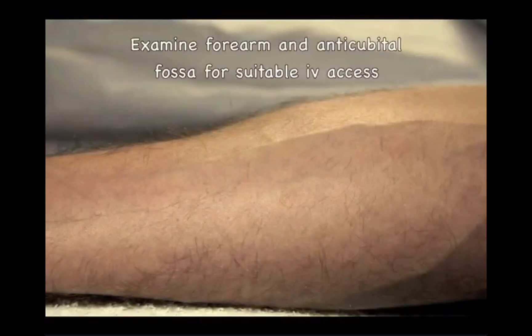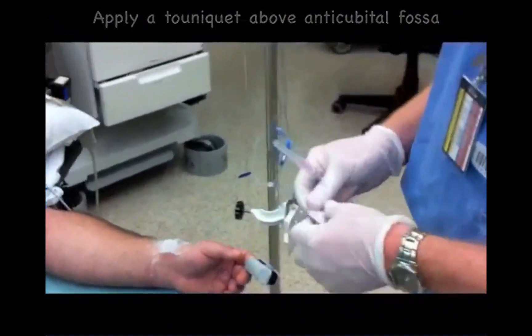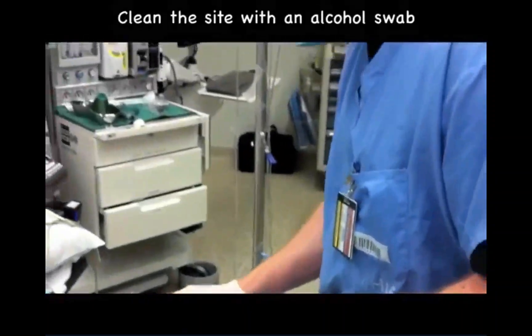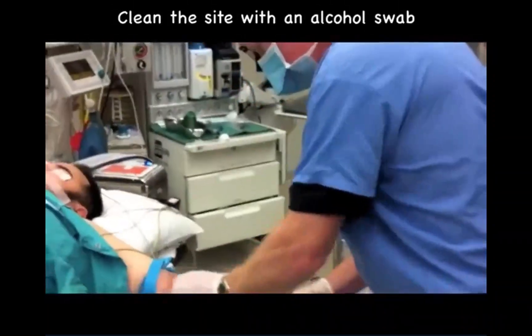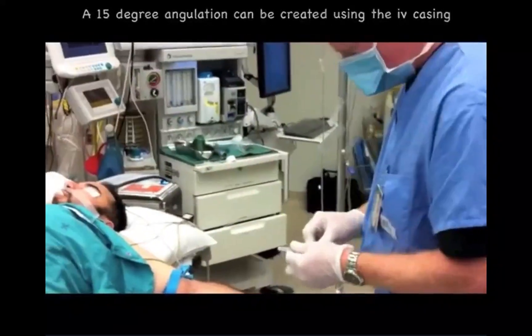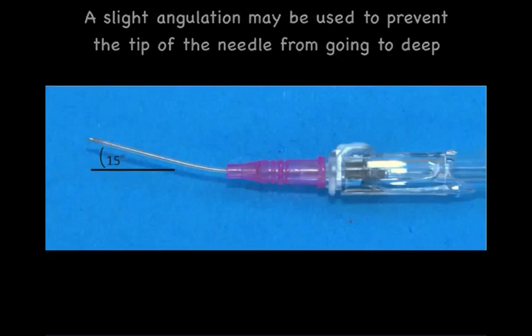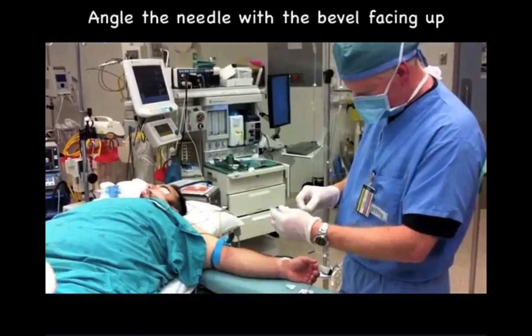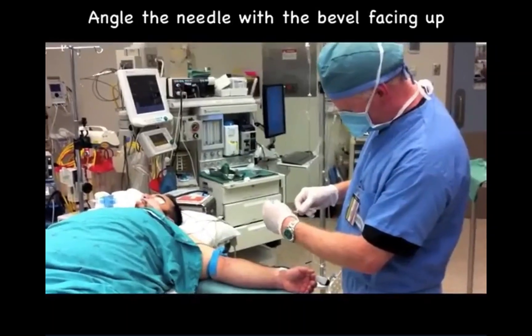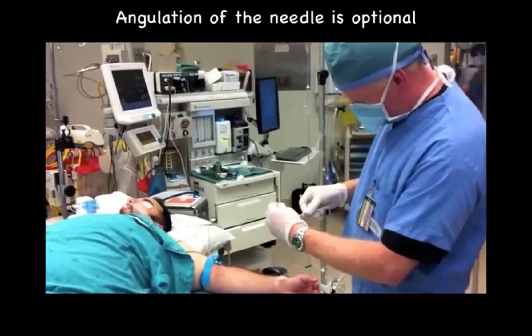Establishing venous access in the forearm is preferred over the antecubital fossa if venous access is required for more than 24 hours. The forearm veins are very superficial. A slight 15-degree angulation of the intravenous catheter can be created using the plastic catheter housing barrel. This can be a useful trick to prevent the needle tip from going too deep and passing through the back wall of the vein. Angulation of the needle tip is an optional technique that can be used for forearm venous access.